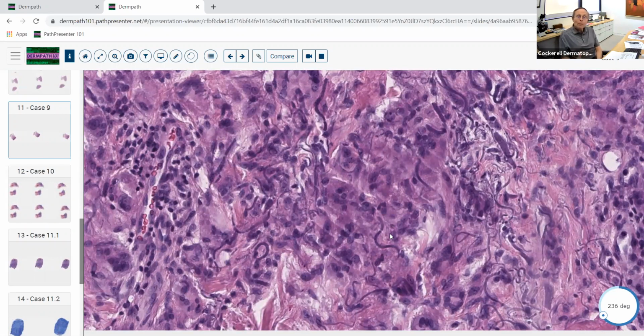Now there's a couple other diseases where you can actually get engulfed elastic fibers with large numbers of histiocytes. One of them is so-called granulomatous slack skin syndrome, which is associated with cutaneous T-cell lymphoma. And you can get large multinucleated histiocytes like this that can engulf these cells. And then there's another situation, which is rare, but does happen on occasion, and that's acquired cutis laxa associated with monoclonal gammopathy. We saw a case of this a number of years ago that the biopsy looked very much like granuloma annulare. In fact, we originally thought it was GA when we did the original biopsy, and it turned out the patient started getting the bloodhound-like facies, her skin started drooping.